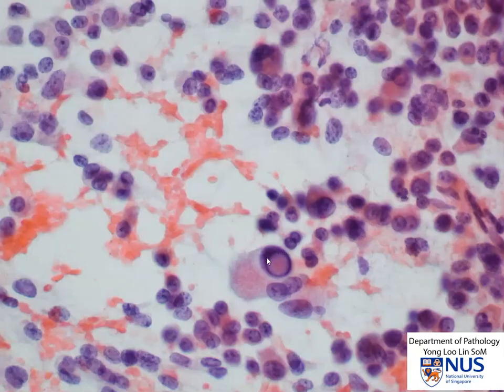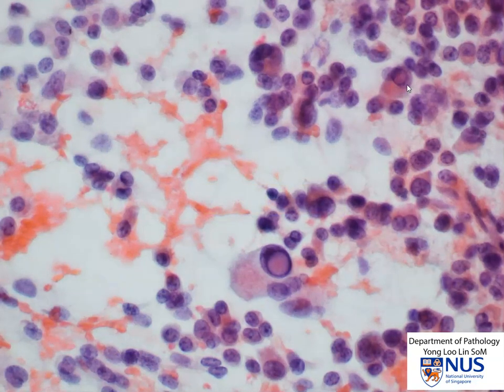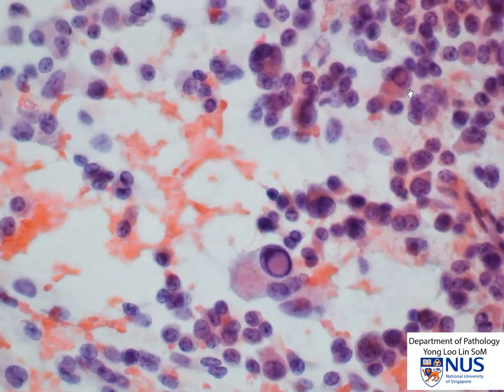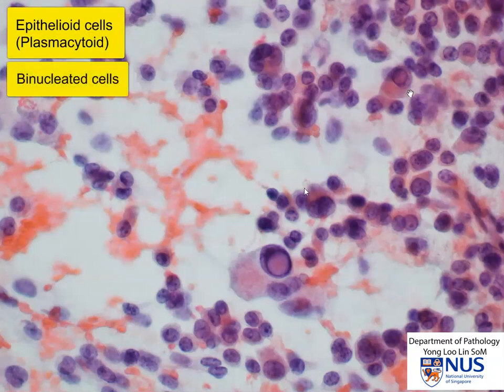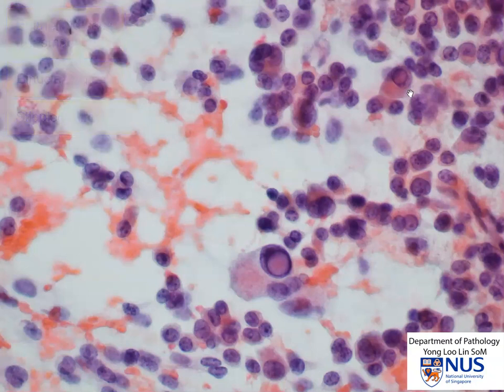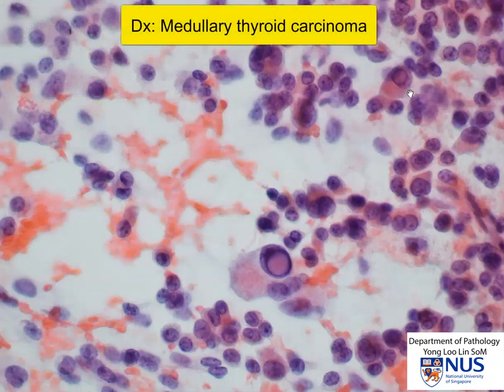Here we actually see a very well-formed intranuclear pseudo-inclusion, and probably there is one there as well when we focus up and down. So what we have is a very cellular smear with epithelioid cells, many of which are plasmacytoid. We have binucleated and multinucleated cells, occasional intranuclear inclusions, stippled salt and pepper chromatin, and an absence of colloid in the background. This is a classical appearance of medullary thyroid carcinoma.